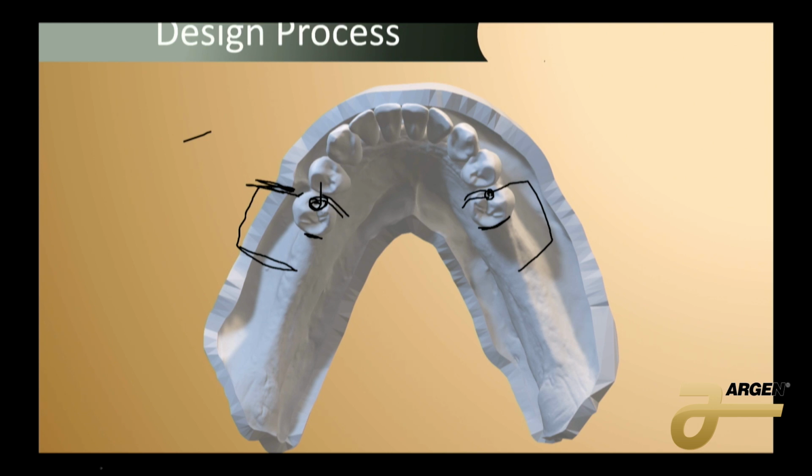From there, I can draw out where my fulcrum line is. So I know that the fulcrum line is that line across your 2 most distal rests. So that's these, there's only 2 rests on this case, so that's here, somewhere there. That's my fulcrum line. Now I need to reciprocate that force. So to reciprocate that force, I need something that goes perpendicular to it like this. I don't want to do it on these 4 anteriors. So depending on space, if you have the space, a premolar is typically better.